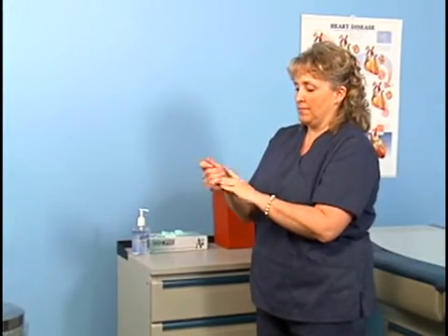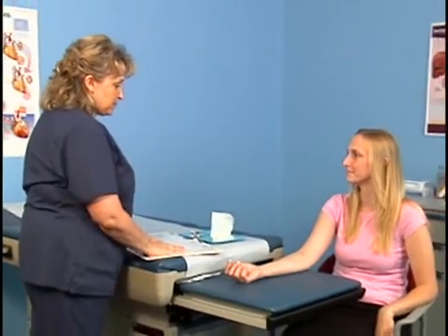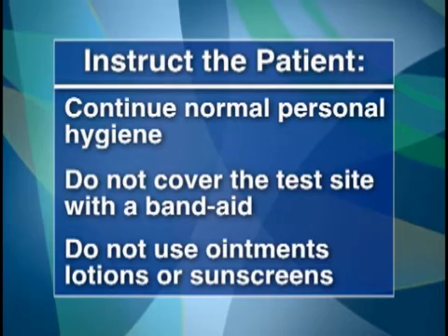Remove your gloves and sanitize your hands. Stay with the patient to ensure that she is not experiencing any unusual reactions. Instruct the patient in the care of the test site.